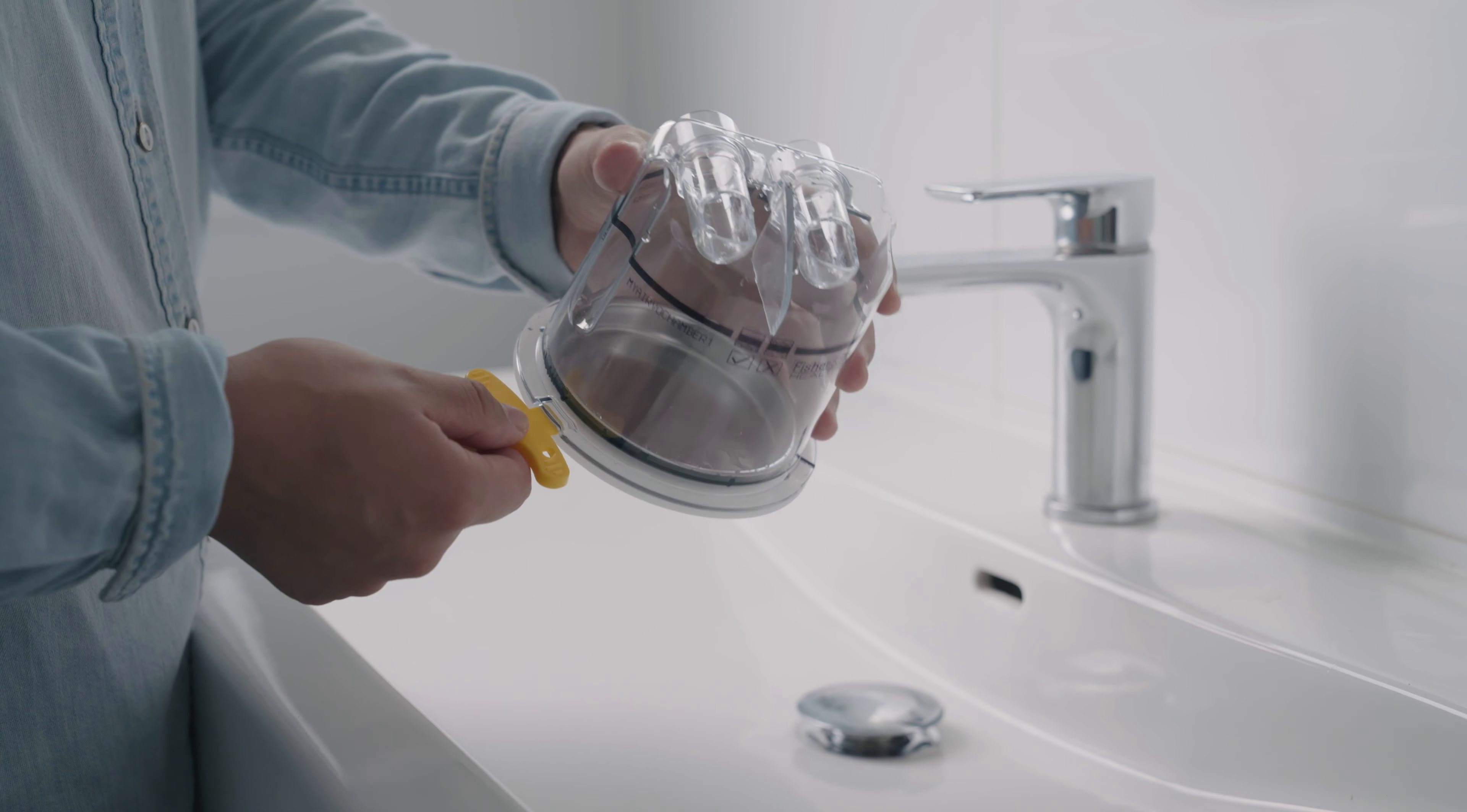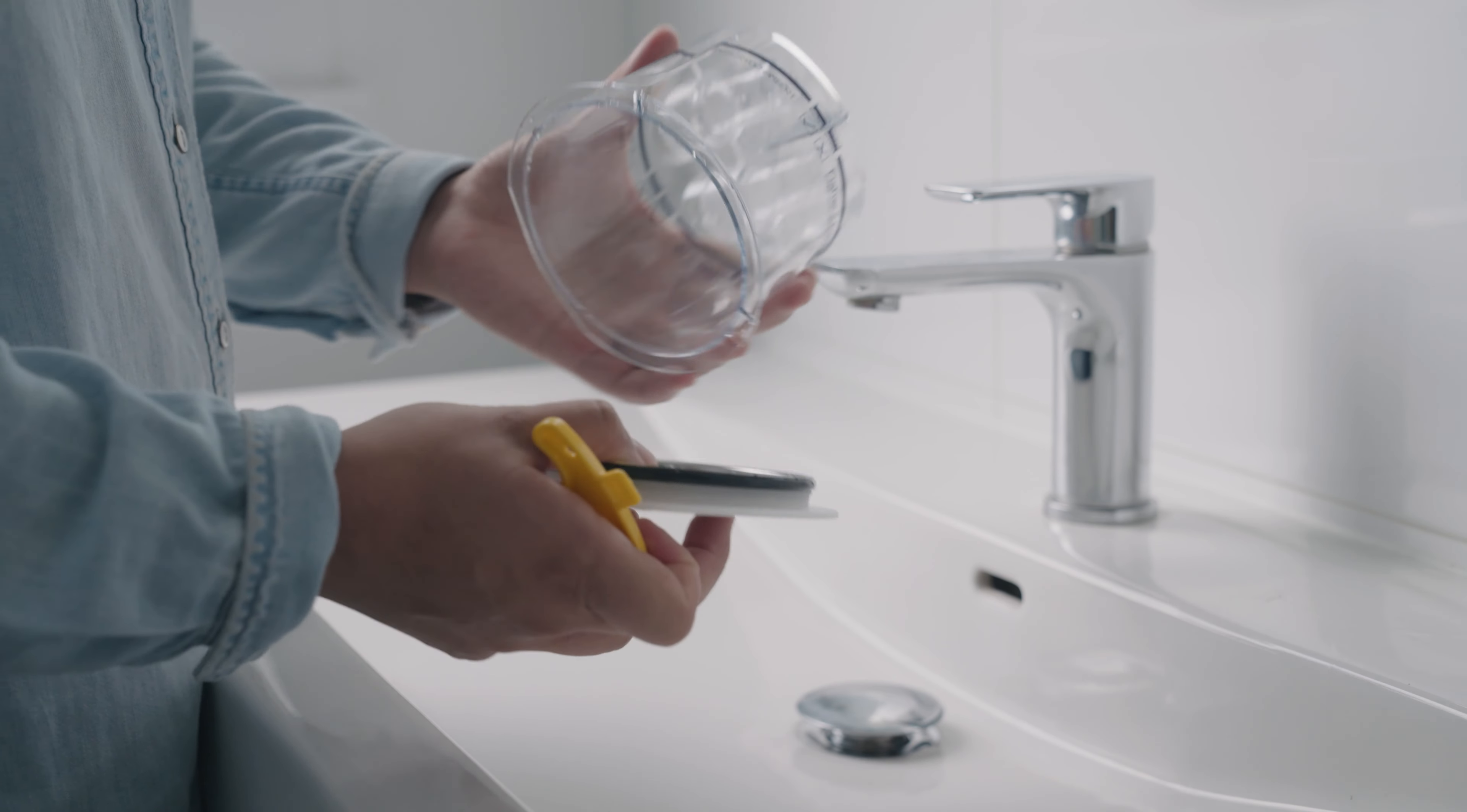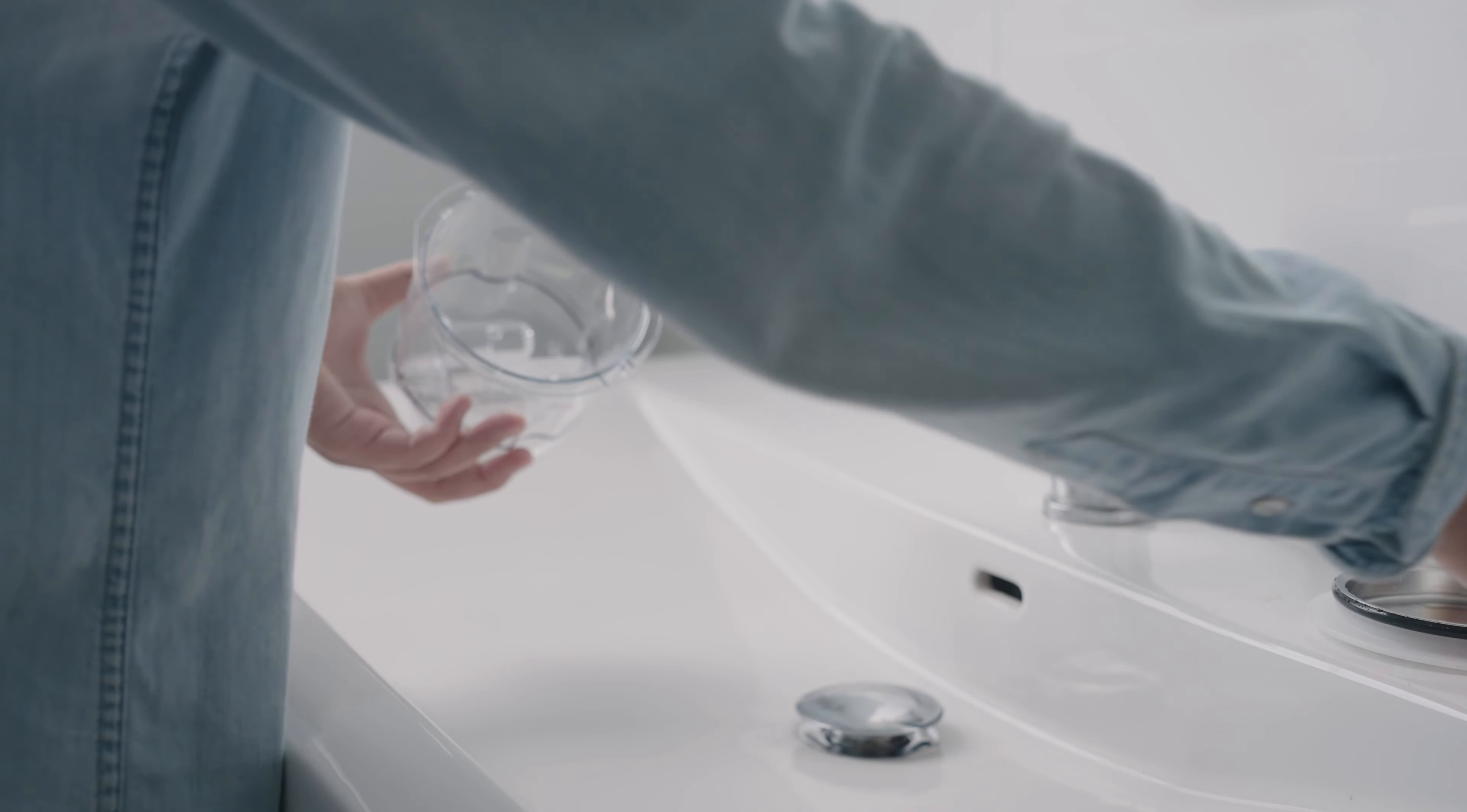Before you first use the Maiva reusable chamber, separate the chamber from the base. Insert the chamber removal tool into one of the slots and twist to open.